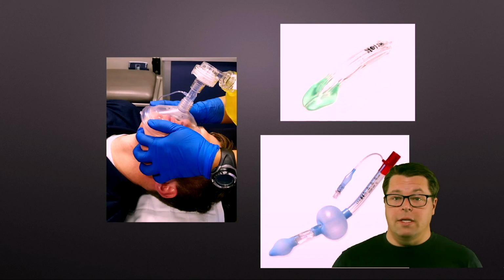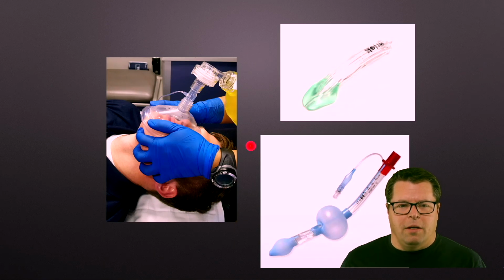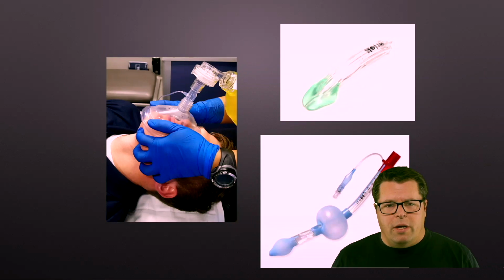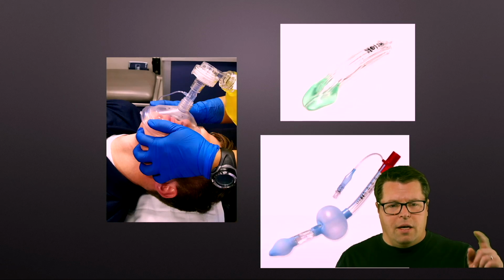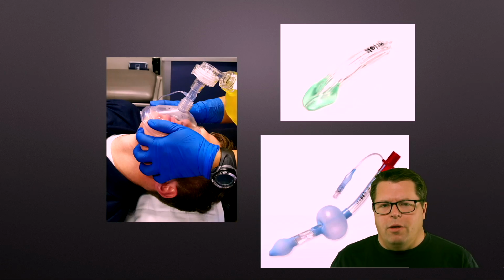By the way, can you use these things in all types of airways? Yes, you absolutely can. In fact, there's been a large amount of data that says, yes, you can use it on an iGel. Yes, you can use it on a King airway or a blind insertion airway device. Otherwise, you can use it on a mask, and the number is actually pretty close to what you get if you were to use it on one of the other devices or an endotracheal tube. So anything that you breathe through for the patient, especially if you're using good mask sealing, good technique, as you ought to be, will give you a reliable end tidal CO2 reading that's pretty close to what you would be getting otherwise.